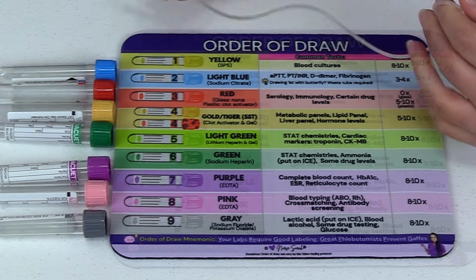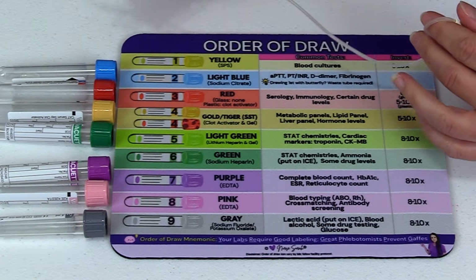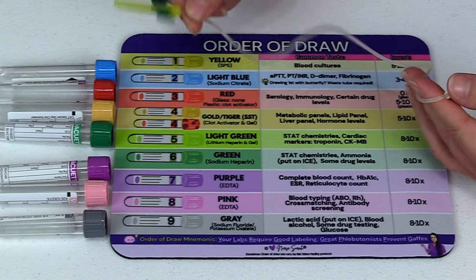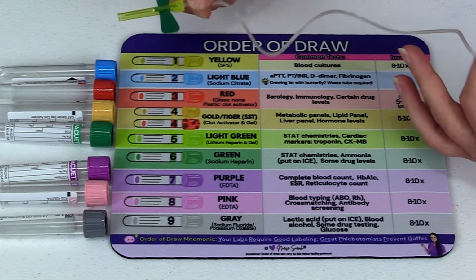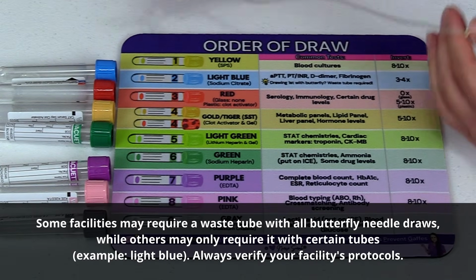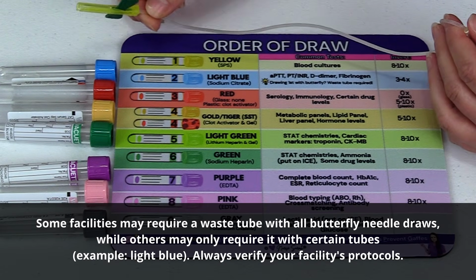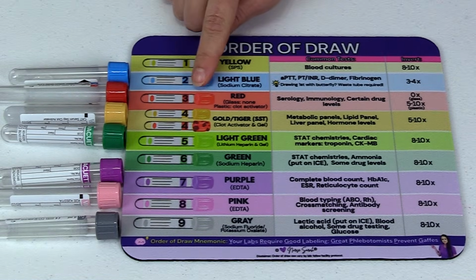Now with that said, one thing I do want to say is that I know all facilities are different with their protocols with how to waste whenever you are using this butterfly tube, because some facilities may say when you're using the butterfly needle set, you have to use a waste regardless. So just keep that in mind and always follow your facility's protocols. Next is the red tube.